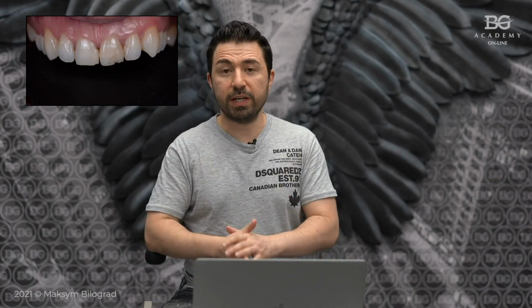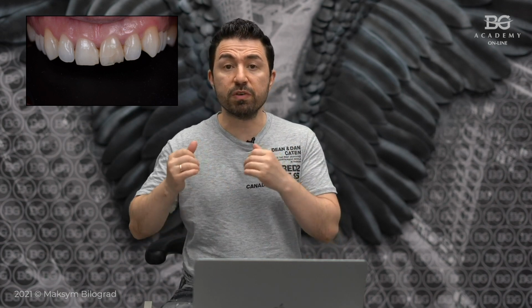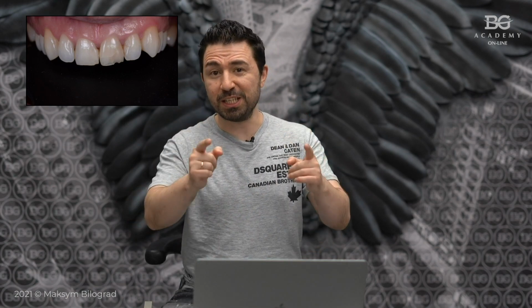With no ortho. Here is the new BG Dental case of aesthetic rehabilitation by means of porcelain veneers in a situation when the patient refused orthodontic treatment. How did we solve the case? See now.